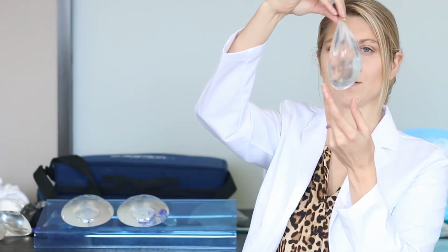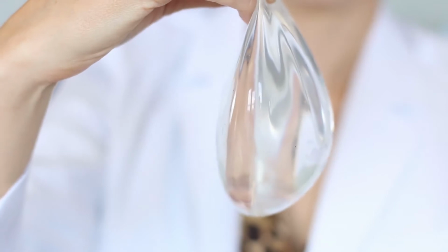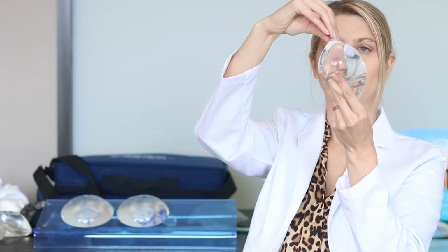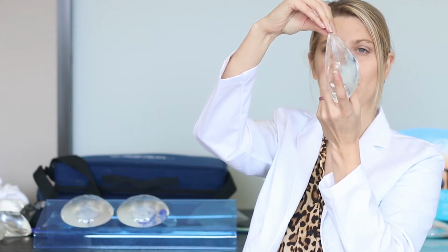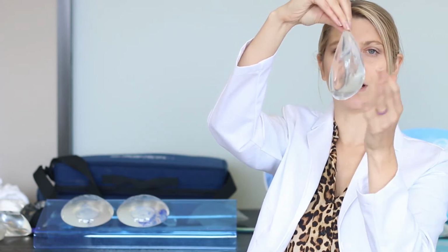So this one is the responsive. You can kind of see how this sits, more of a teardrop shape, but whenever you put it in a bra, it can kind of go up. But whenever it's just sitting on your chest, you're going to get much more of a teardrop shape. They're also a lot softer whenever you squeeze them.